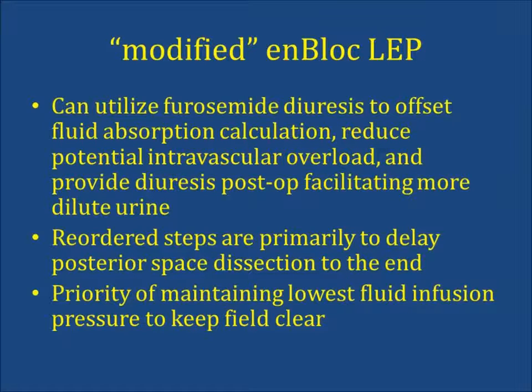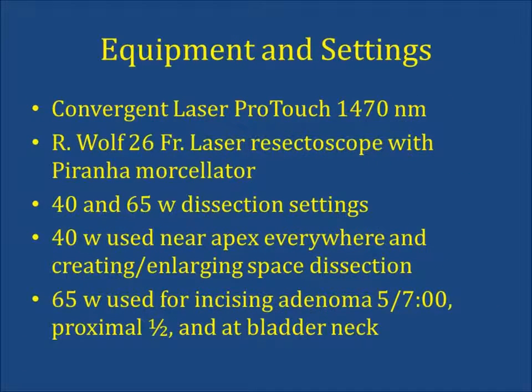Reordered steps are primarily to delay the posterior space dissection until the end. The priority is to maintain the lowest fluid pressure possible. Equipment includes the Convergent Laser ProTouch 1470 nanometer diode laser, Richard Wolf 26 French laser resectoscope. The settings are 40 and 65 watts for dissection.